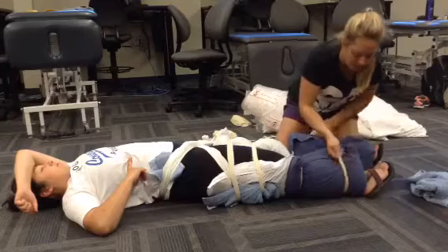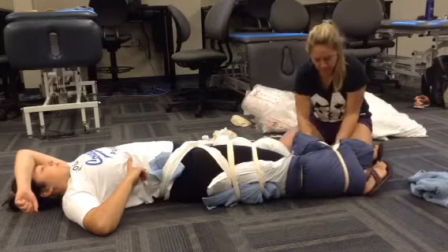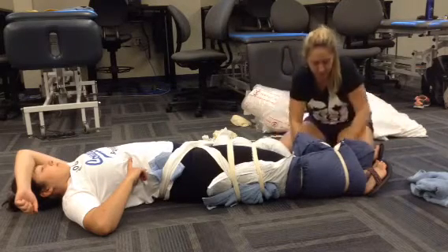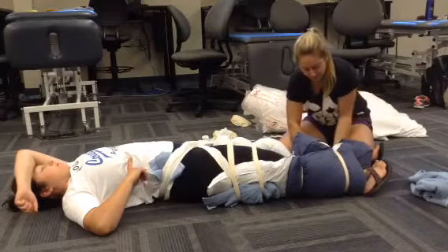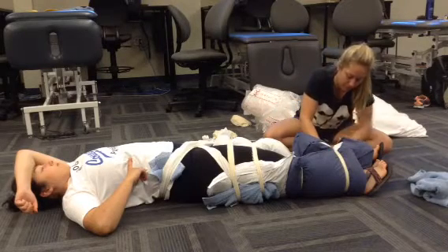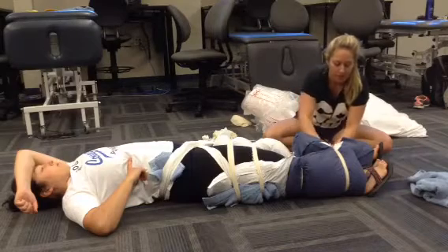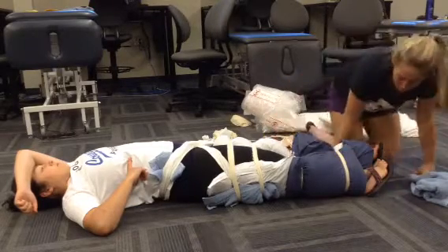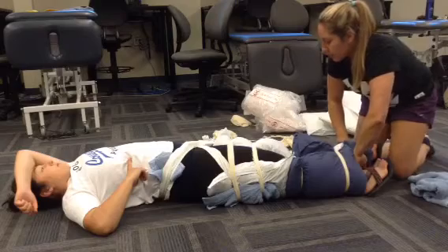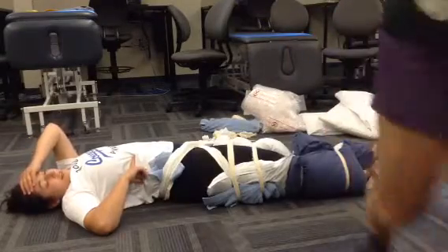And lastly, at the ankles — not too tight. Making sure all my ends are tucked in. And I'm going to check PMS again. Can you feel me touching you? Can you wiggle your toes for me? Pulses are present. How does that feel? As comfortable as it will be.